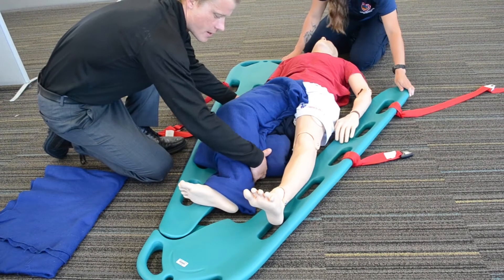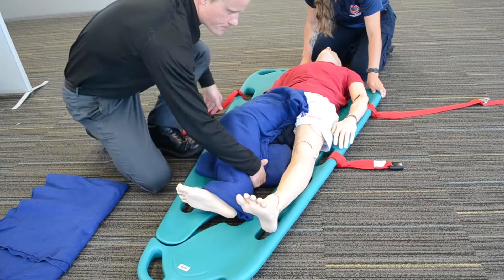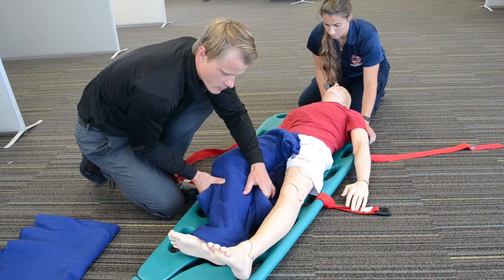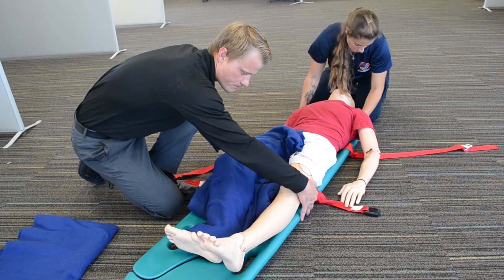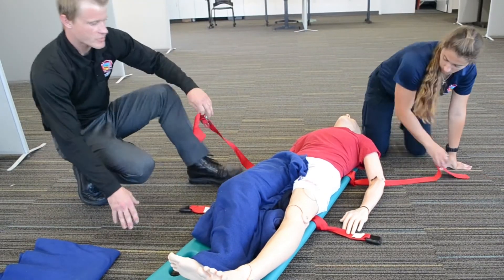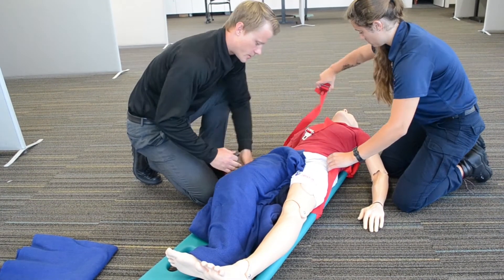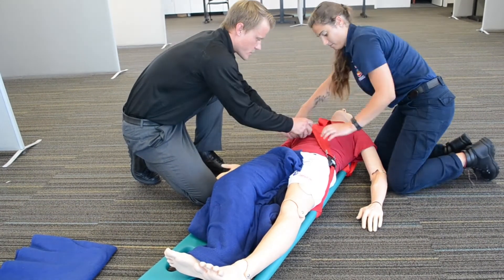We want to make sure that we are not moving this any more than is absolutely necessary. We will be putting in these two halves of the scoop stretcher very slowly — there's no need to rush through this process. This mannequin is very light compared to an actual patient, so it looks easy while we're demoing it. On an actual patient, you need to be much more careful. It will take a little bit longer, but as long as you minimize movement onto the backboard, it will decrease the amount of pain your patient experiences.